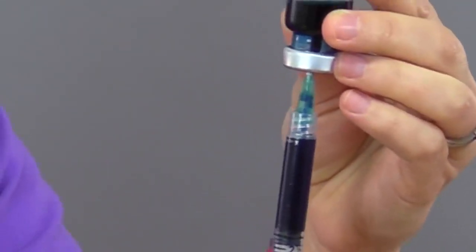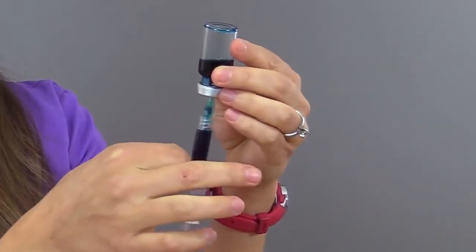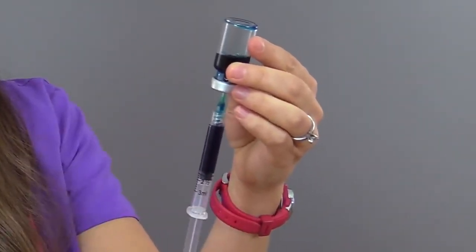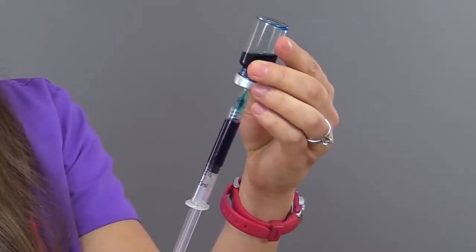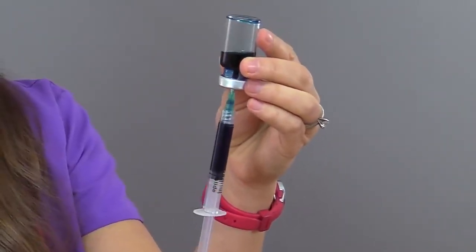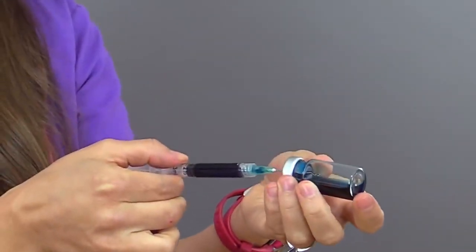Now you want to check for any air bubbles. If you see any, lightly flick the barrel to remove any air bubbles, and if you have any present, you want to push them out into the air space and then check again and make sure you're at the 2 mark and confirm that you have the appropriate amount of medication. Then you want to remove the needle from the vial.